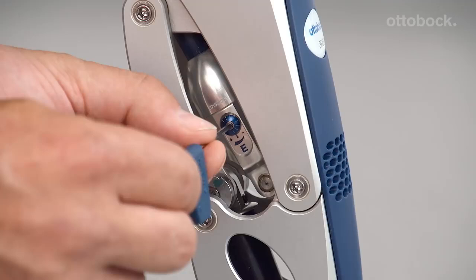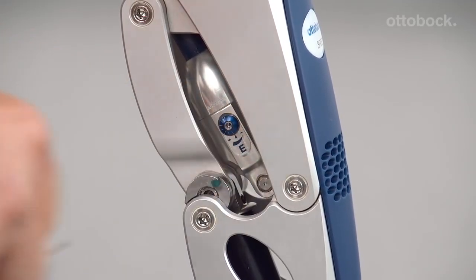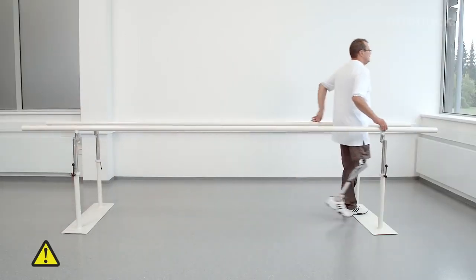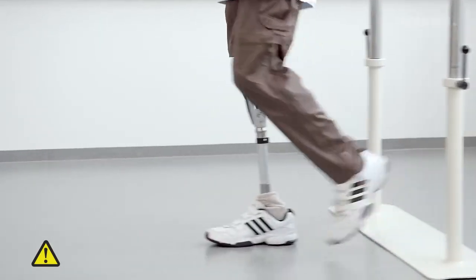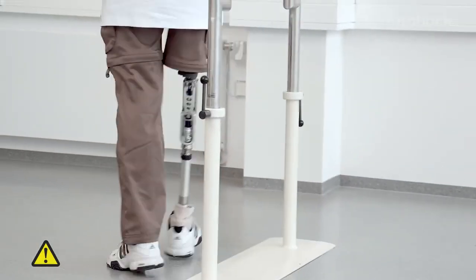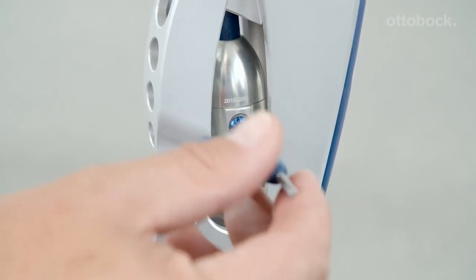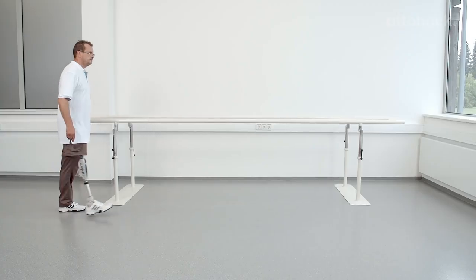Here the extension damping is shown at its maximum. As shown here, an extension damping set too high means that the knee joint no longer comes into full extension, which could lead to a fall. Therefore, please decrease the extension damping slightly to make sure that the prosthetic knee is in full extension when the prosthesis is loaded during heel strike.